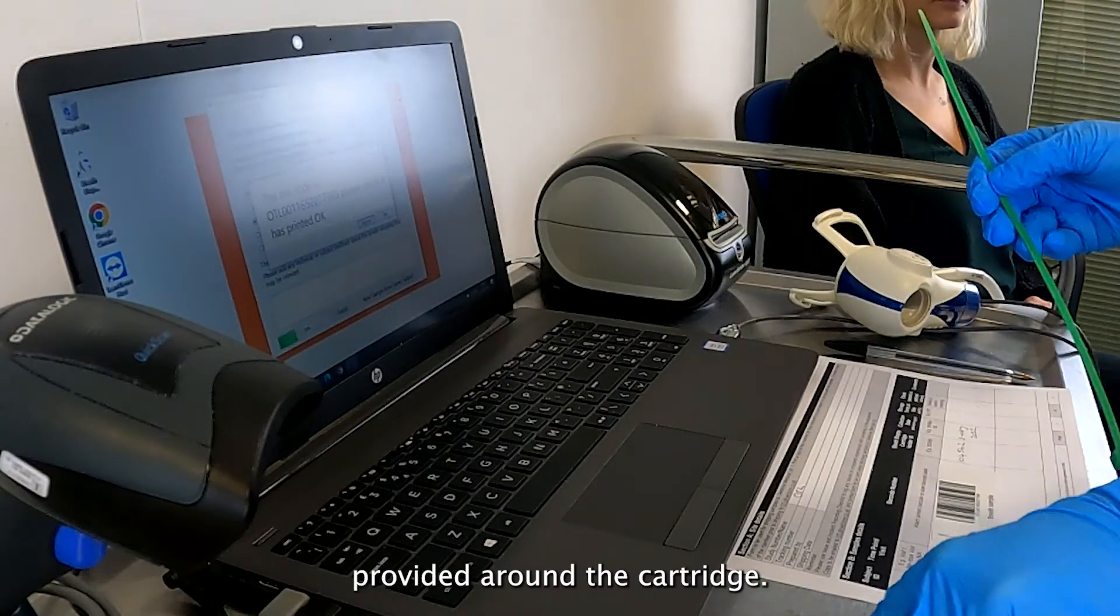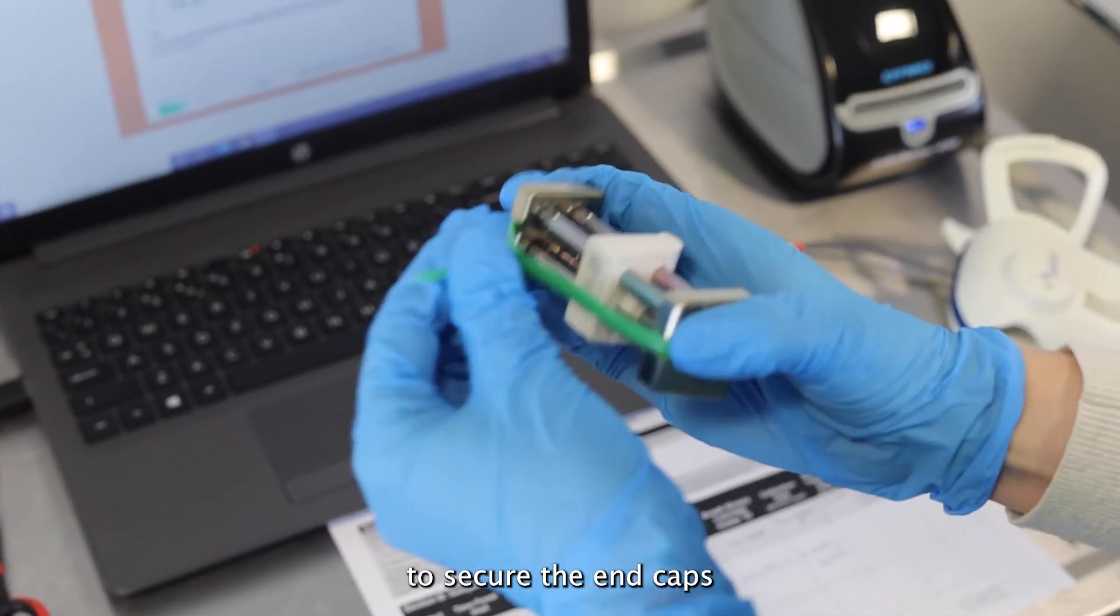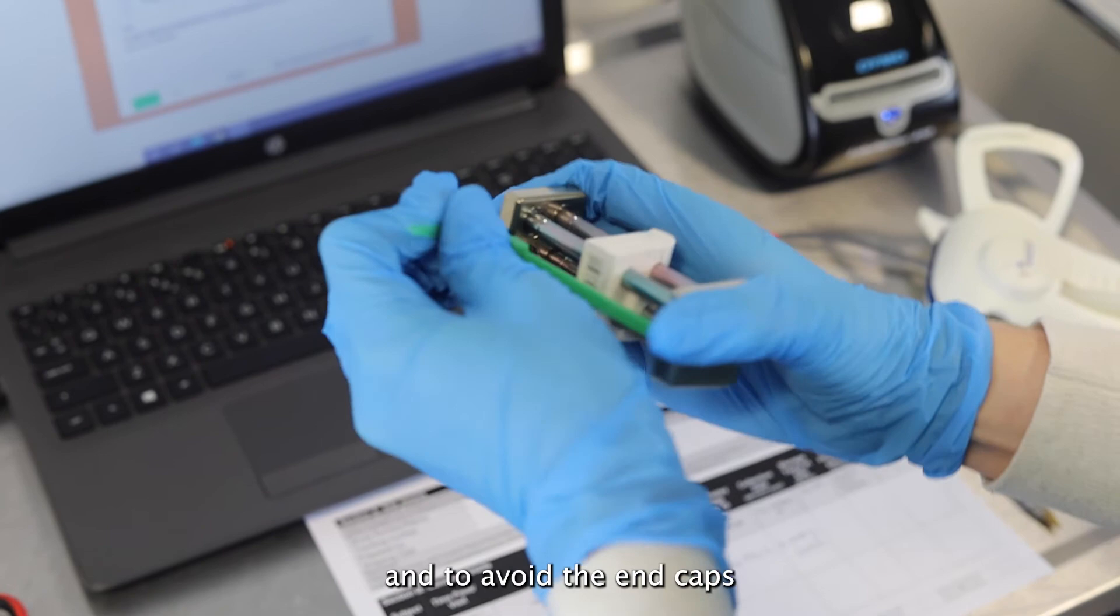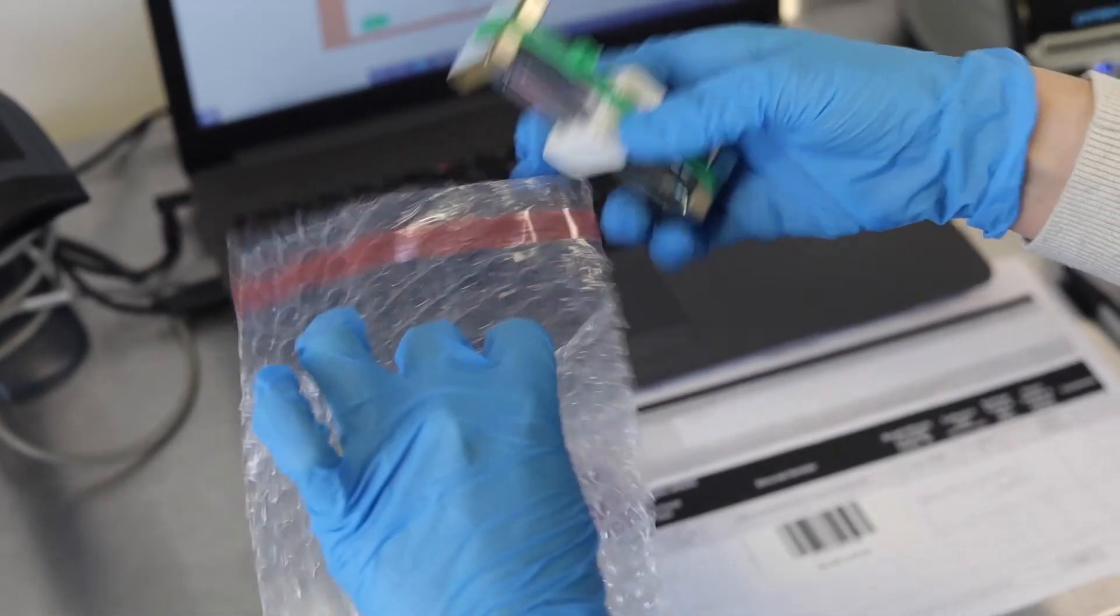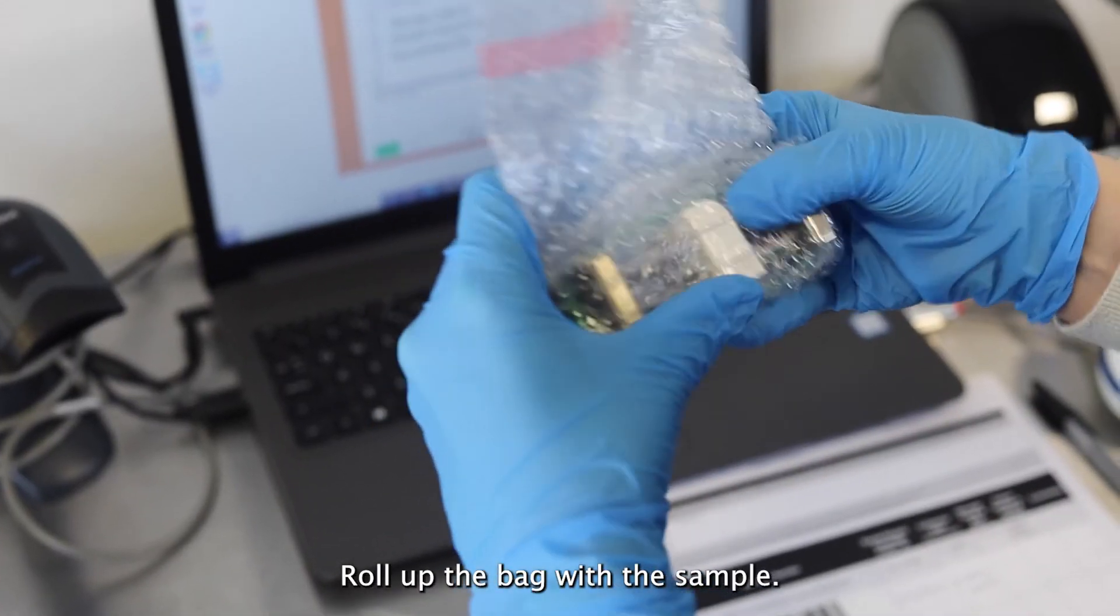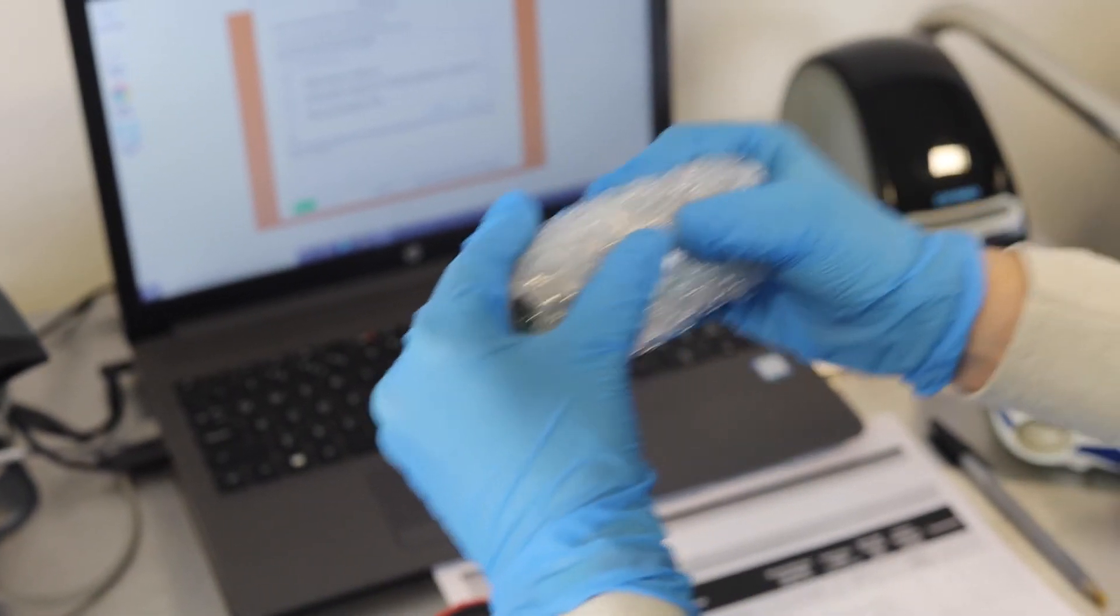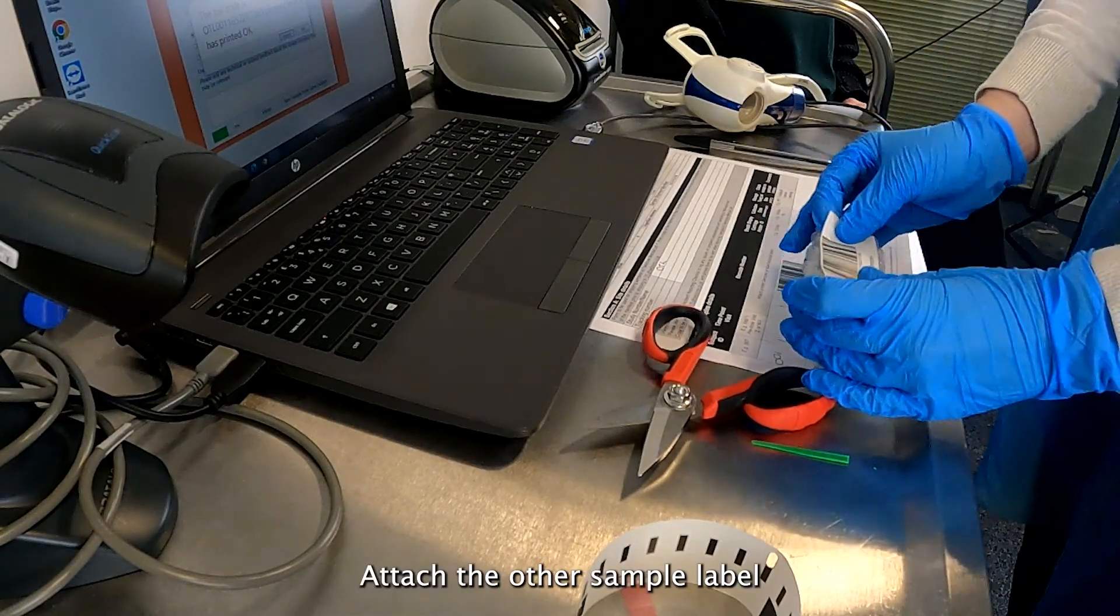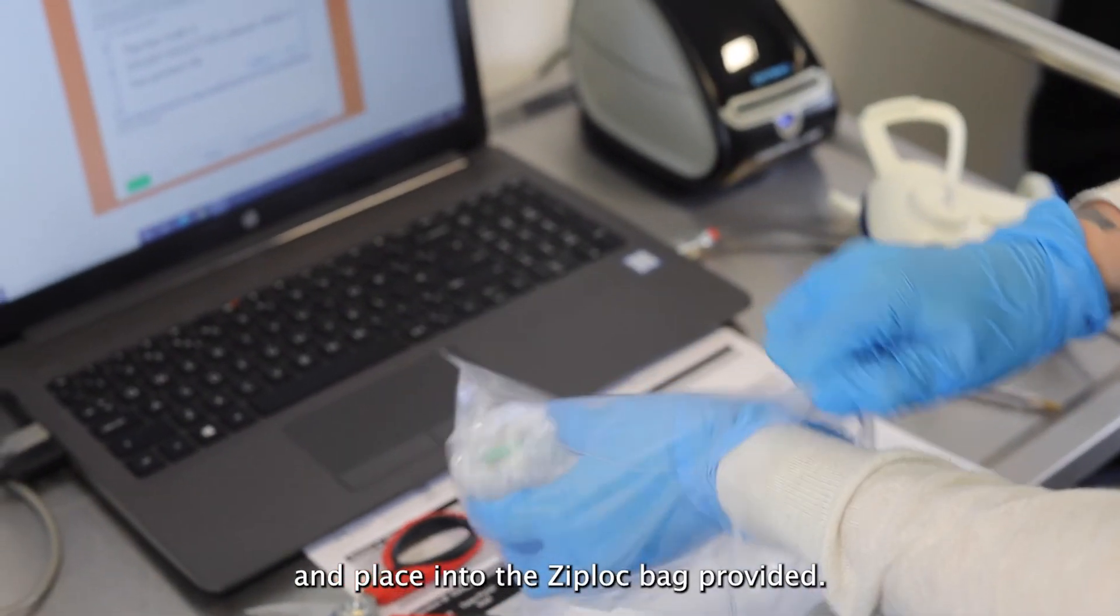Fit the cable tie provided around the cartridge, pull and tighten the cable tie to secure the end caps and to avoid the end caps being removed by accident or during transportation. Place the cartridge in the bubble wrap bag provided. Roll up the bag with the sample, remove the adhesive strip and secure. Attach the other sample label to the bubble wrap bag and place into the ziplock bag provided.